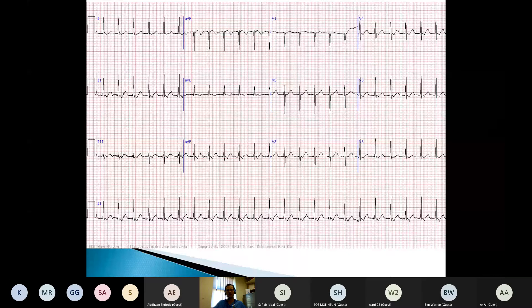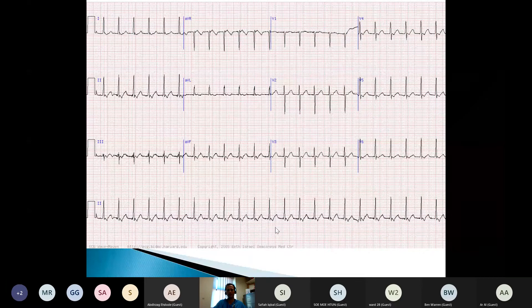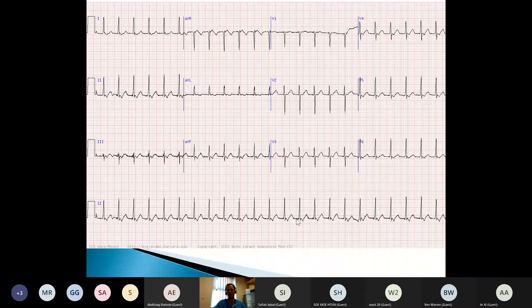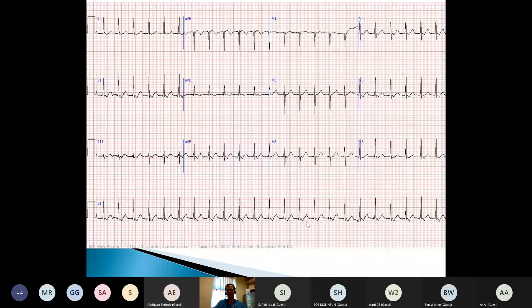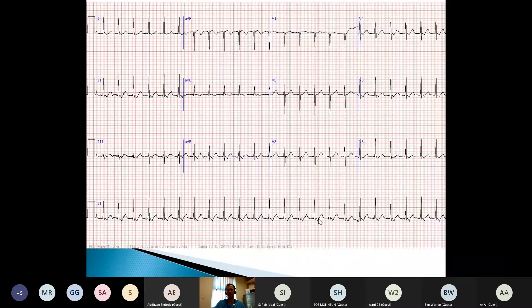No P waves and regular — so if it was atrial fibrillation, we would expect it to be irregular. If it was a sinus tachycardia, we would expect to see P waves. Can you see here in lead two this dip between the QRS and the T wave? That is very likely to be an inverted P wave. If you get the sinus node where the natural pacemaker is, you get an upright P wave. But if the P wave is coming from lower down, it can be conducted backwards up through the atrium, causing an inverted P wave. This doesn't make sense for that to be part of the T wave at that point. You'd know for sure if you had an ECG in normal sinus rhythm — if that bit was not visible, then you'd know this was the P wave caused by the tachycardia.